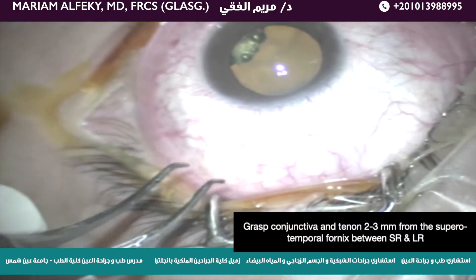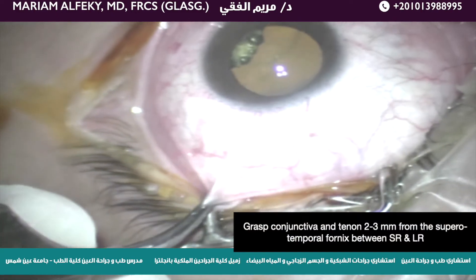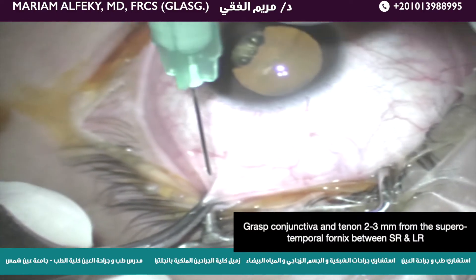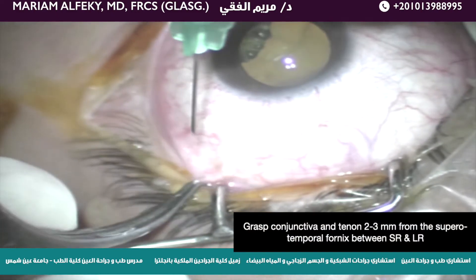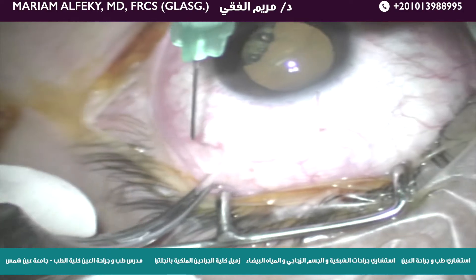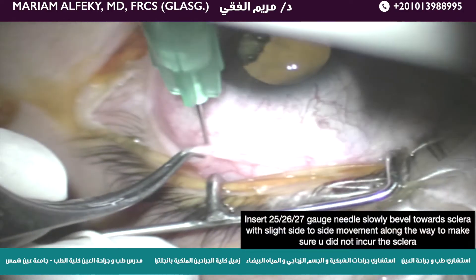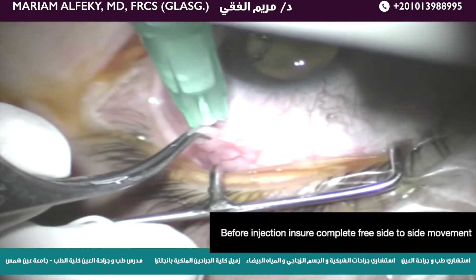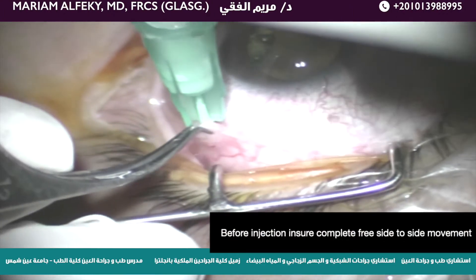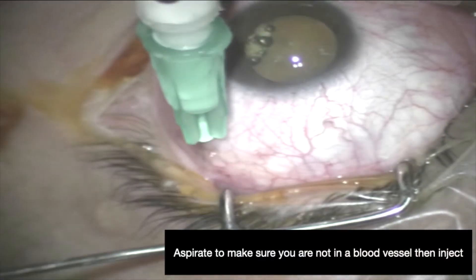To give the posterior sub-Tenon's injection, grasp the conjunctiva and Tenon's capsule strongly 2-3 mm from the superotemporal conjunctival fornix. Then insert the needle with the bevel toward the sclera, slowly, making sure that there is complete free side-to-side movement of the needle before injection.